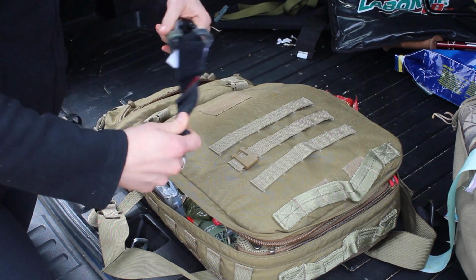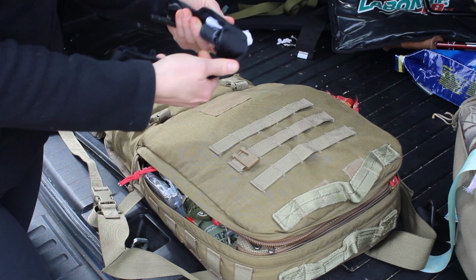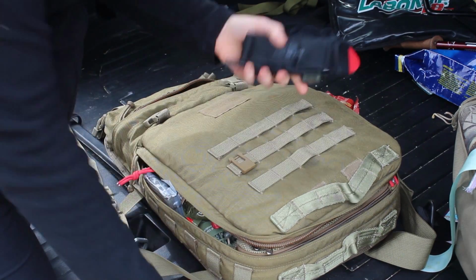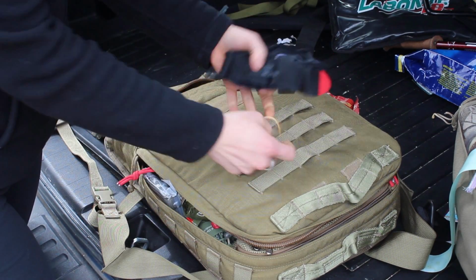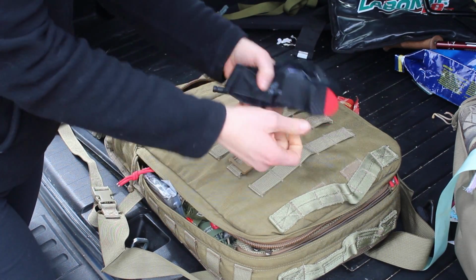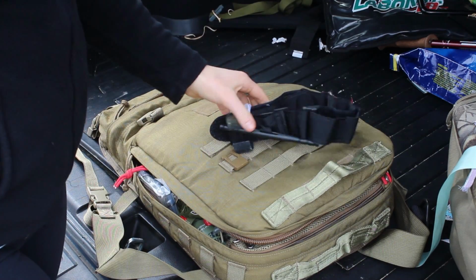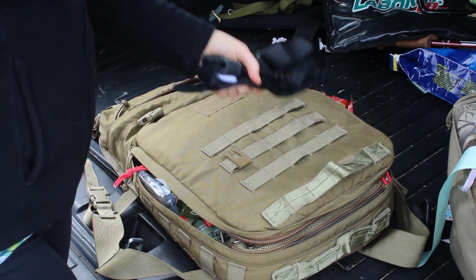Basically, they lose all of their insides. And so having a tourniquet readily accessible, that's really important first thing. So that's why the tourniquet is, and I've just attached them here on the loops here. I've attached them with rubber bands so that way I can rip them off and go. Okay guys, so the tourniquet's on the outside here, readily accessible.